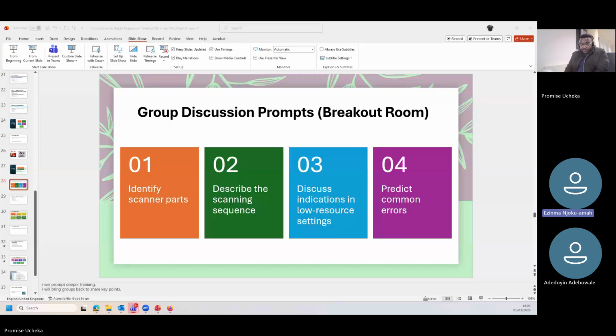Not necessarily where there is no lab. The one I know, where there is no lab, doesn't have to do with intraoral. Instead, as you are taking it, you send it immediately via mail. The lab receives it immediately.